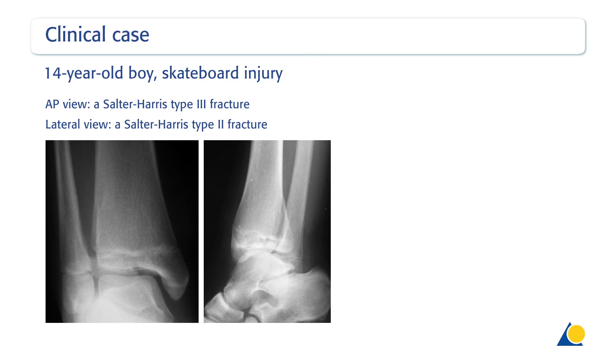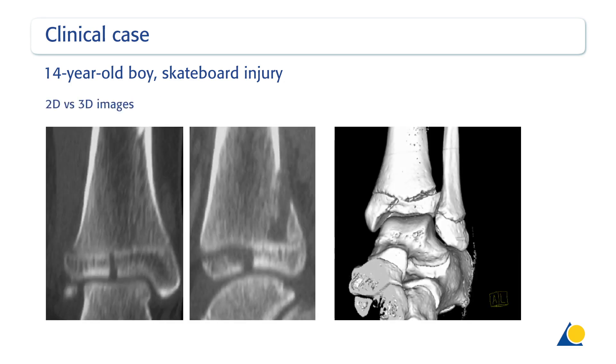In these x-rays of a 14-year-old boy, the AP view shows a Salter-Harris type 3 fracture. The lateral view shows a Salter-Harris type 2 fracture. The fracture pattern is highly suggestive of a triplane fracture. In this x-ray, the displacement of the fragment more than 2 mm is apparent. A CT scan was used for a more precise diagnosis.